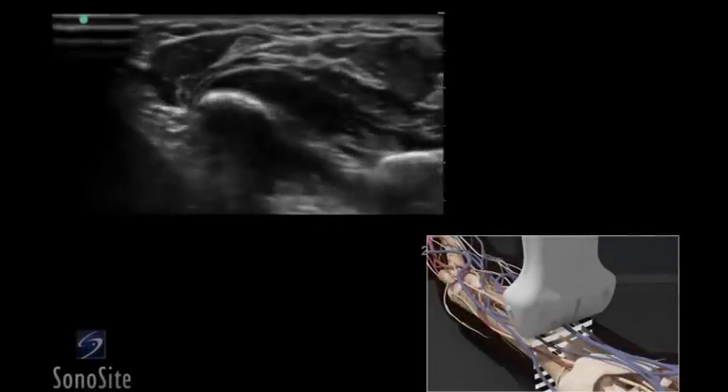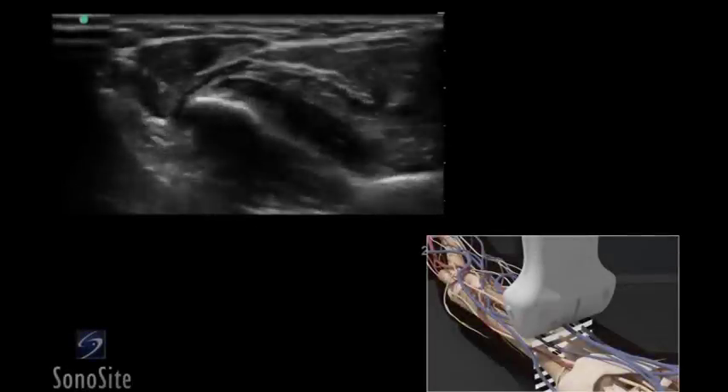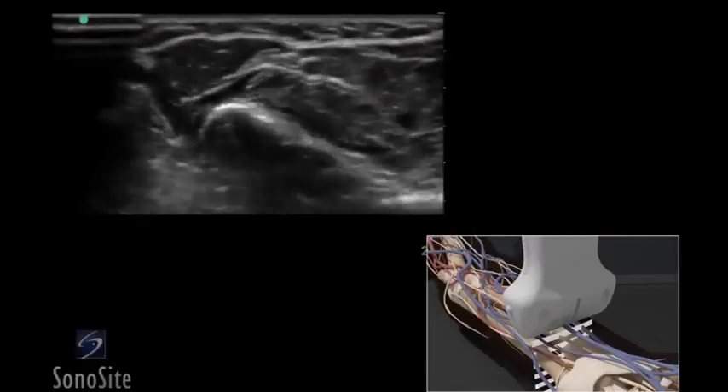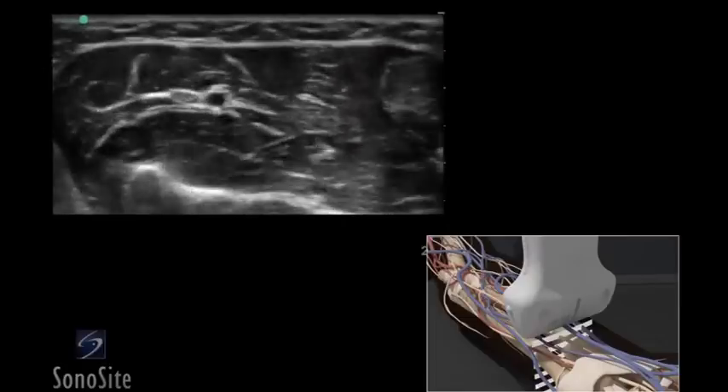A linear array transducer with a nerve exam type is used to perform a median and ulnar regional nerve block. The target depth is approximately 1 to 2 centimeters in an 80-kilogram adult.